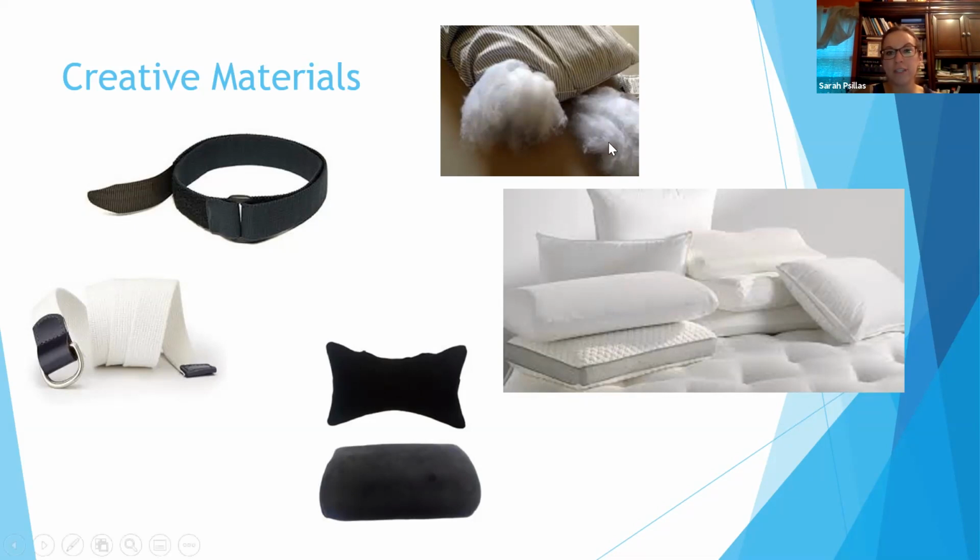So you can have previously made pillows and add to them, or create your own. These two pillows at the bottom, one is more like a head neck pillow, sort of like when you travel, that you could put in the back of someone's seating system to help with their lumbar spine area or their neck. And then the pillow below it is a lumbar support pillow. And so you could use that at the lumbar part of the spine.